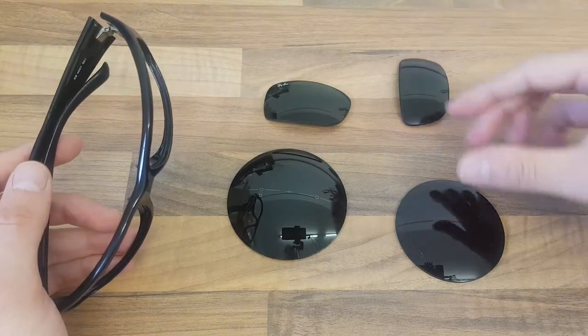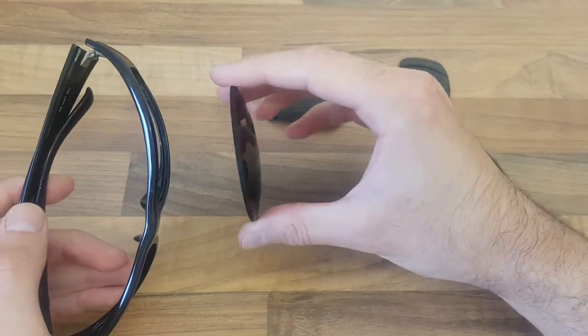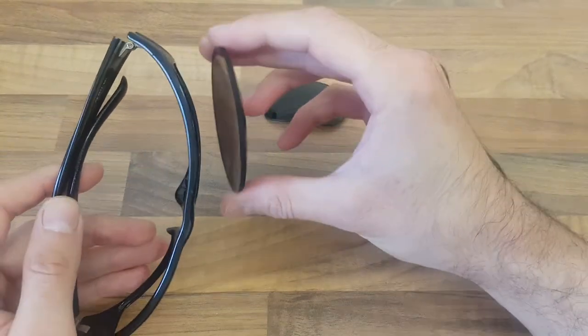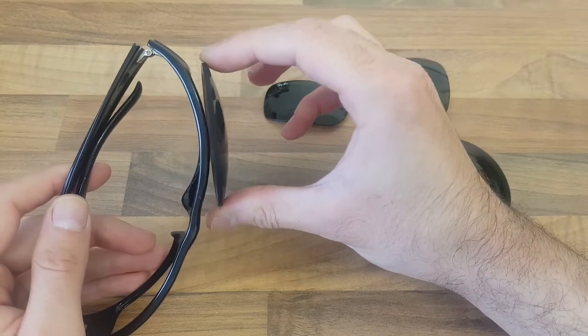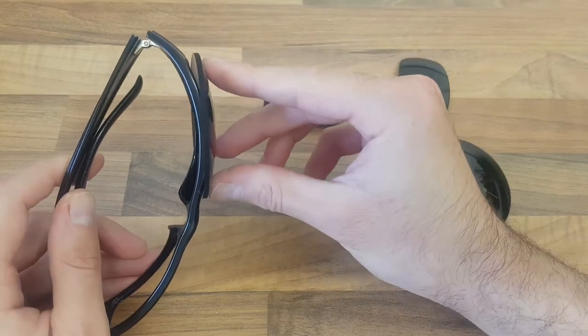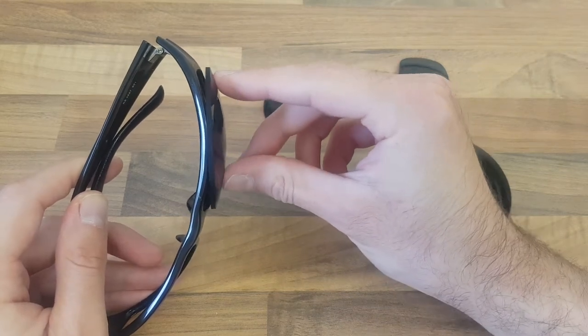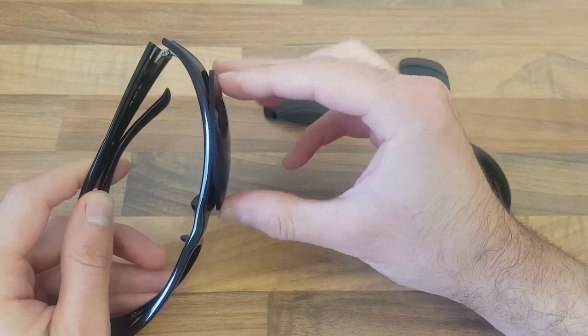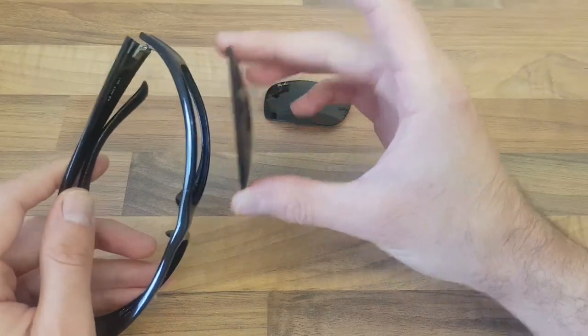You run into a problem when you take a prescription lens, which is much flatter and not as curved, and the frame doesn't really match up against the curvature of the lens. You can't bend these lenses or heat them up and bend them, because when you do that you basically ruin the lens, the coating, or you change the prescription — so that lens isn't going to work in that frame.